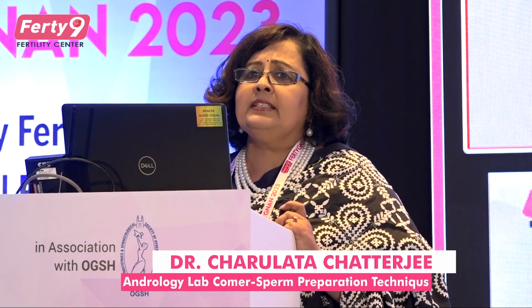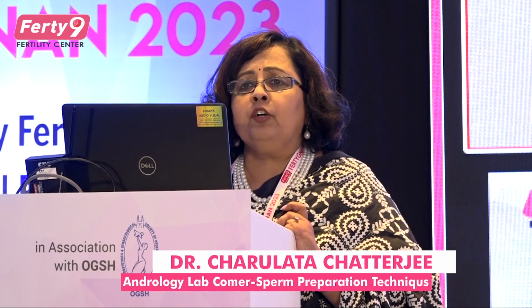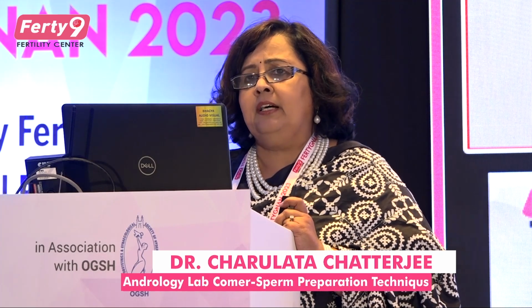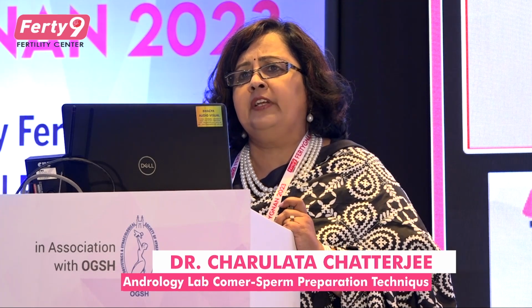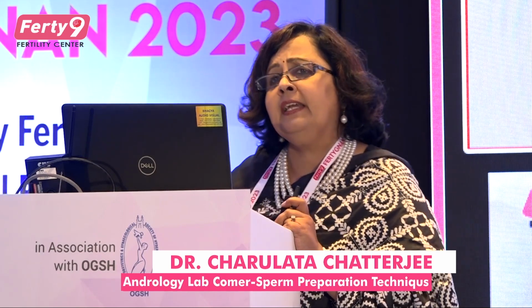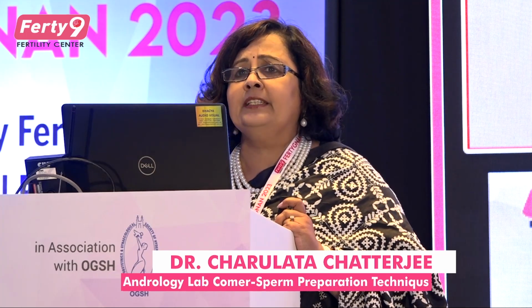Every technique has its advantages and disadvantages. The advantage of this method is we get a good crop of motile spermatozoa, but the disadvantage is that sometimes in an oligospermic sample, it will not give a good retrieval. Another disadvantage is that because we centrifuge it, there may be chances of oxidative stress, and that ROS may hamper the fertilization process or the implantation process. The best method for preparing any kind of spermatozoa, either normozoospermia or oligozoospermia or any, is the density gradient.